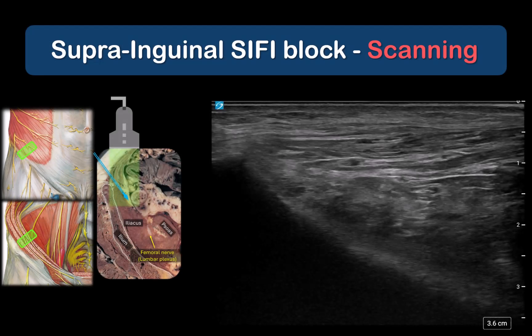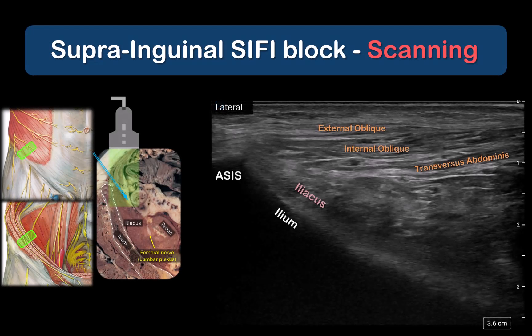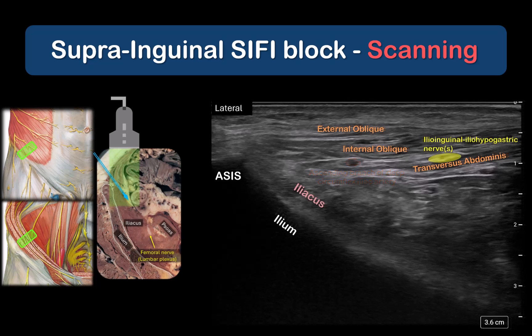The patient in this example is an older individual with relatively thin muscle layers, typical of many hip fracture patients. Careful survey scanning identifies the ascending branch of the deep circumflex artery and the ilioinguinal and iliohypogastric nerves in their expected location between internal oblique and transversus abdominis.